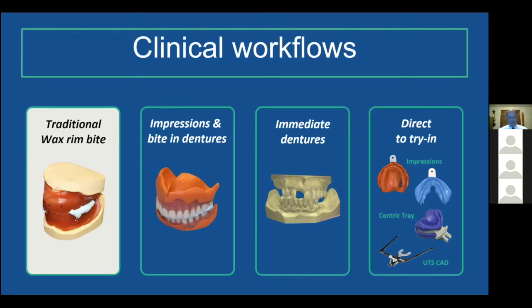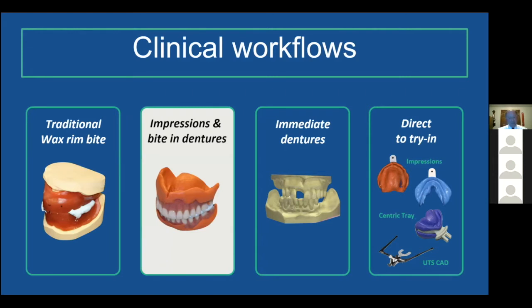We could do better. And plus, you're not taking advantage of all the other digital aspects that you could clinically. So it's a possibility. If this is your comfort level and this is where you want to start, it's okay. And maybe you're really good at doing wax rims. If you are, that's great, because then it serves as a good communication to the laboratory. But just saying.